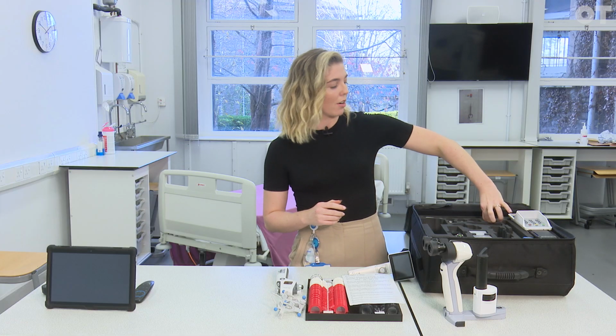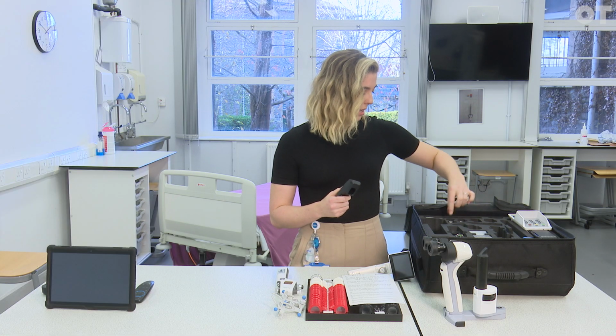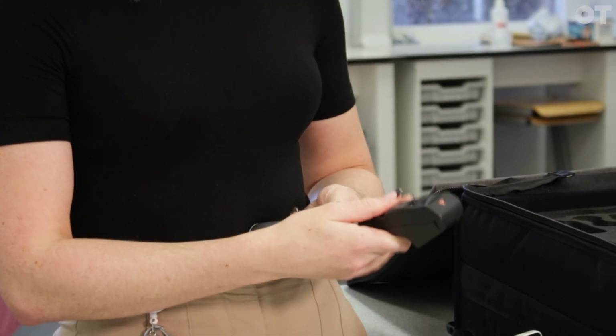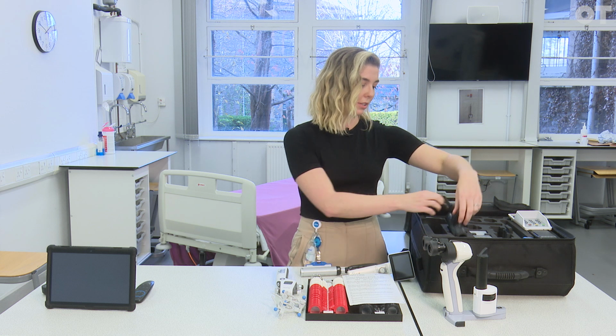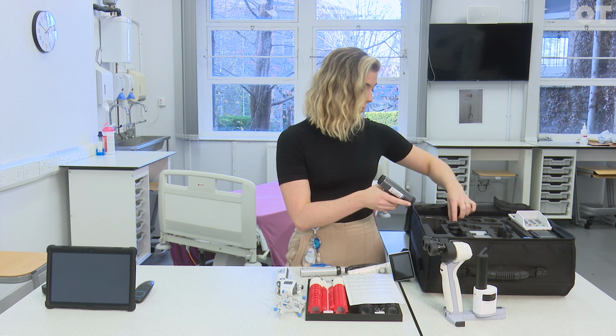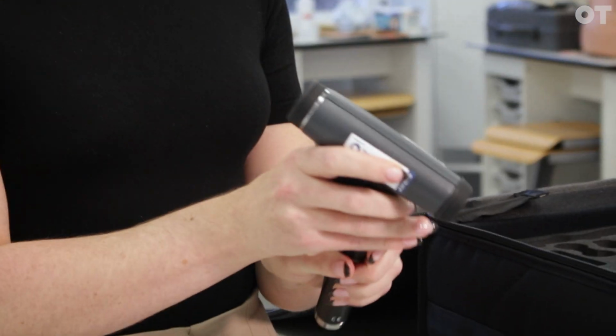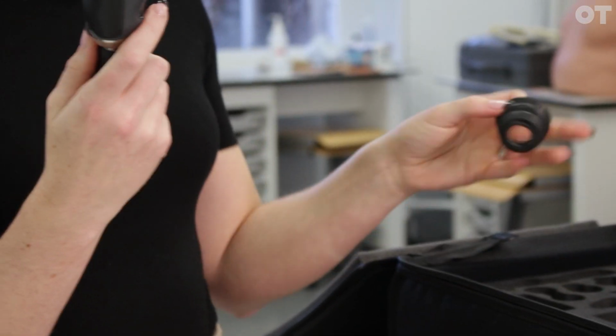We've obviously got a retinoscope and ophthalmoscope, so I'm hoping people will already know what they're for. They're useful obviously for testing at home. A lot of our colleagues like to use a Panoptic ophthalmoscope. They give you a nice wide field of view. It's nice to have a few different ways of viewing someone's fundus depending on what you're looking for.